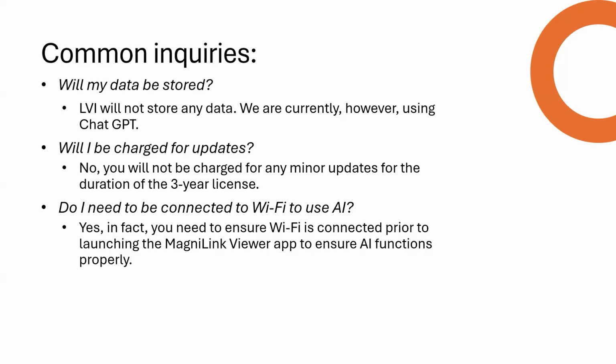And or we give you a QR code. You can scan that QR code because we added that to our software. And if you scan that QR code, it's going to put the license code in there for you. So those are kind of just some of the very high highlights of it.